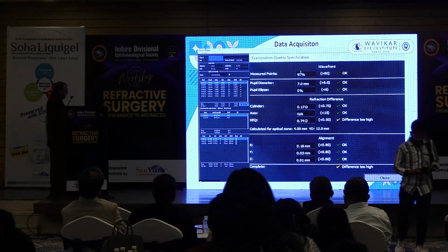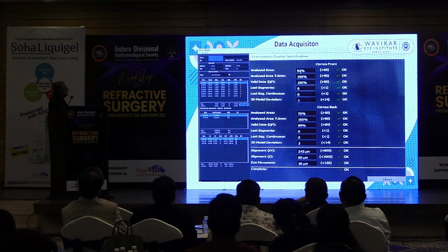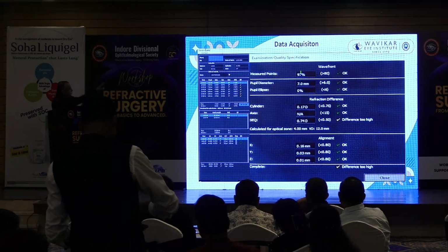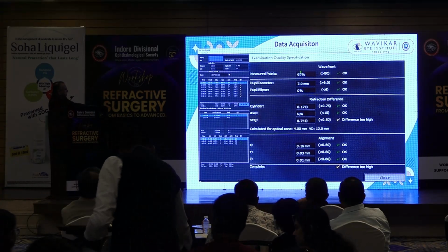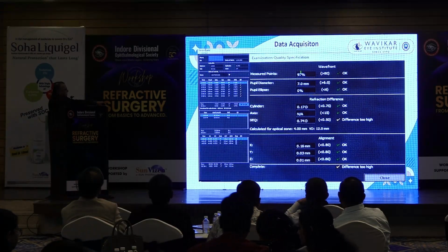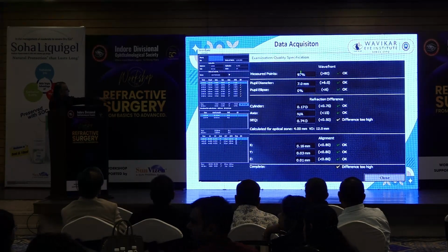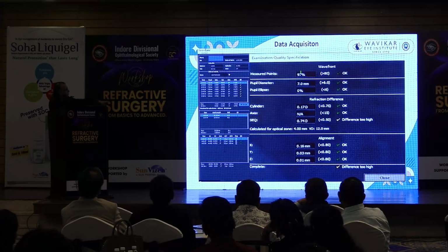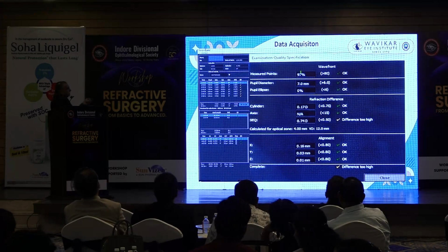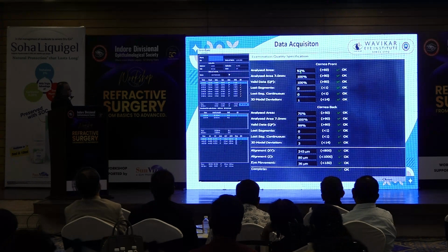So when you click on this thing, this yellow or green tick, you get a pop-up window like this, which tells us details about that reading. Now this is a screen regarding the aberrometry, and you can see that there is only one yellow, and this says that spherical equivalent is the only problem. Otherwise, all the scores, the reading is good. And then you can decide, in addition to what the machine has done, whether to choose or delete this reading, exclude.